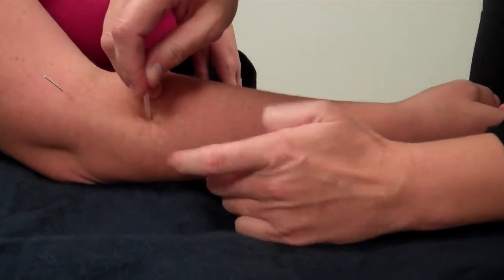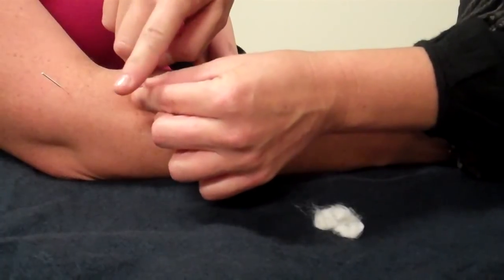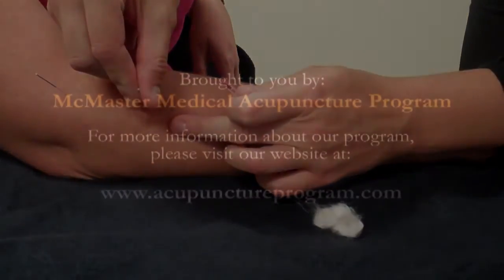So again, you've got it marked with the tube. You're swabbing. I'll do this one — you can push. Again, holding the handle only and pushing.